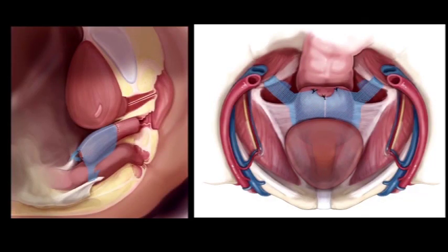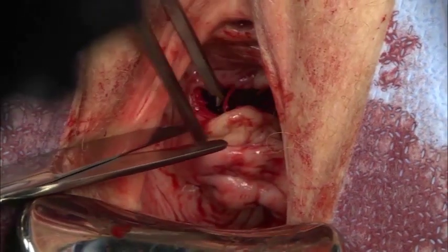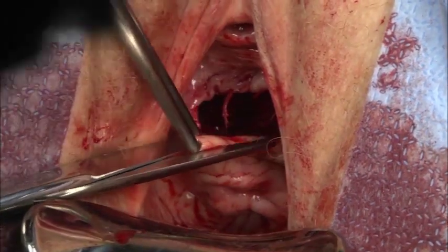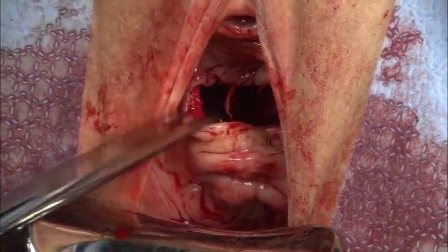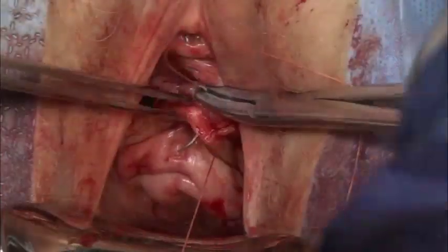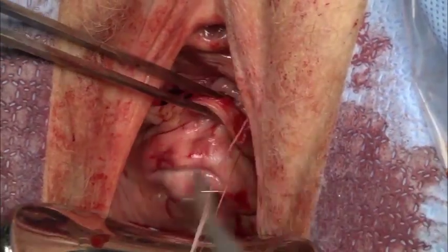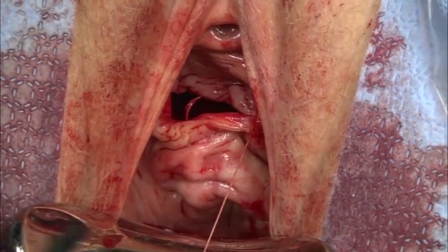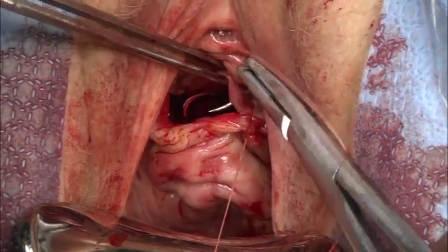Once the mesh placement is complete, the length of the vagina should be restored with full longitudinal coverage to the apex. I occasionally resect a redundant portion of vaginal skin before final closure. The goal is to leave adequate laxity of the anterior vaginal wall but to avoid excessive redundancy. The vagina may be closed with a running absorbable stitch and the vagina packed until the following day.